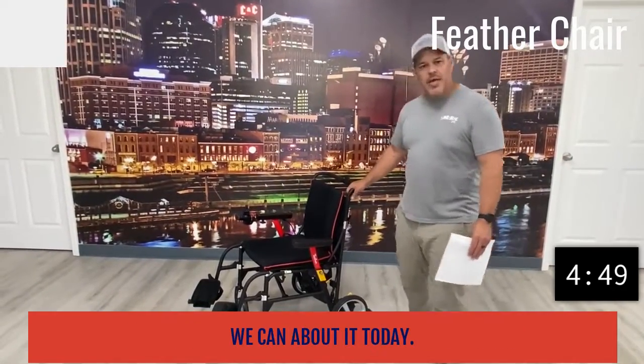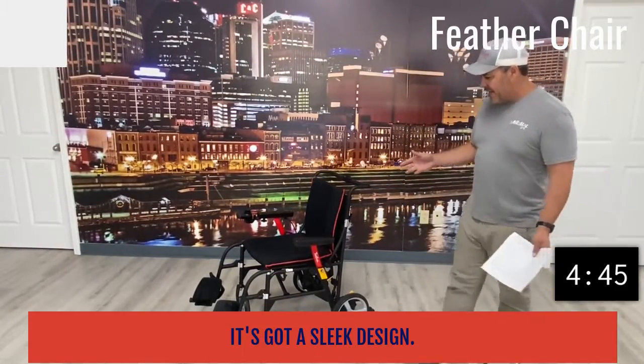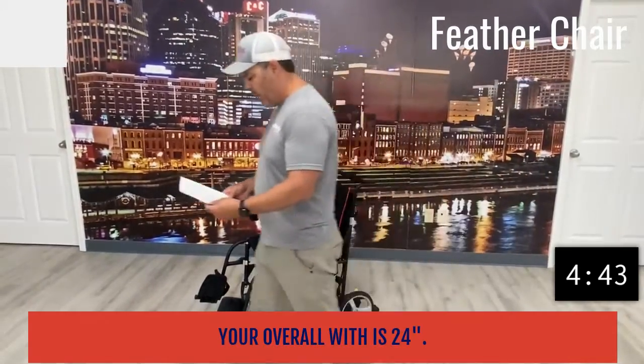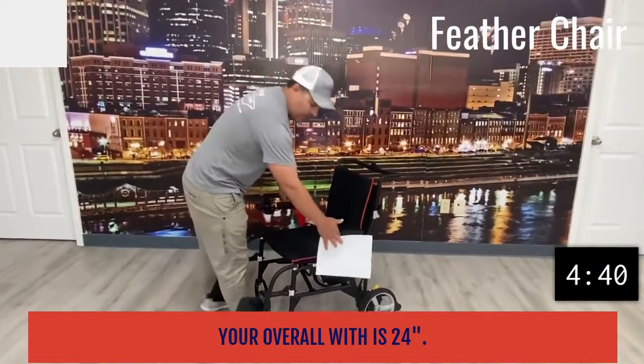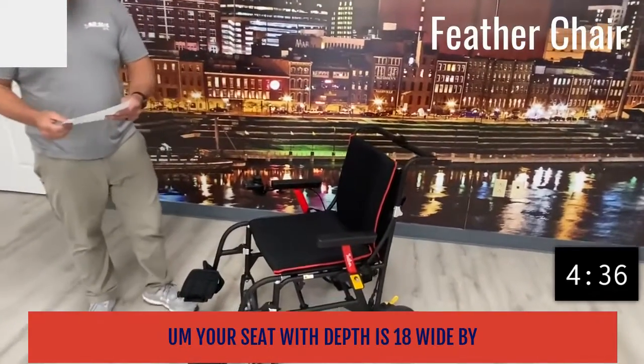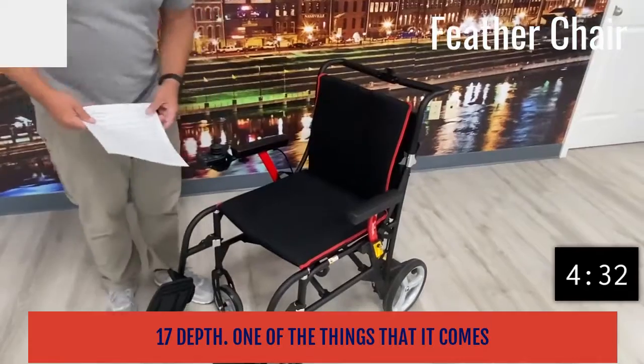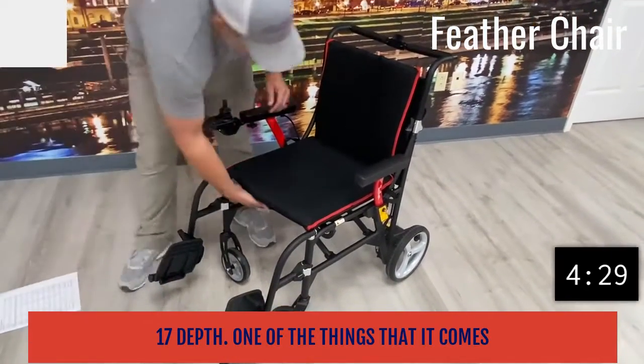Starting out, it's got a sleek design and it's very small. Your overall width is 24 inches, and your seat width and depth is 18 inches wide by 17 inches deep.